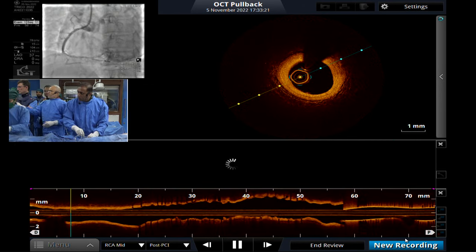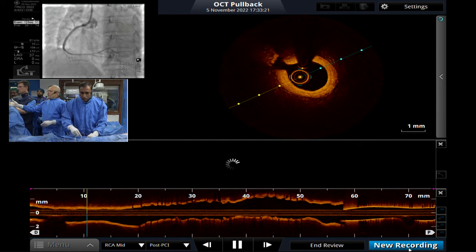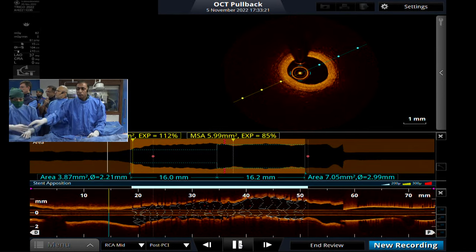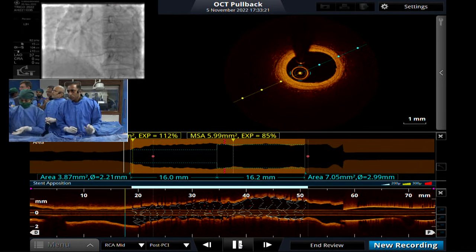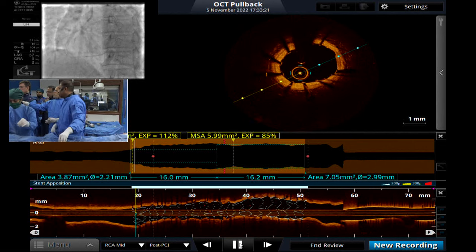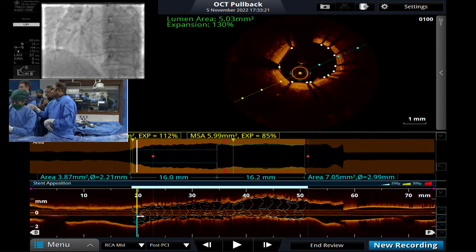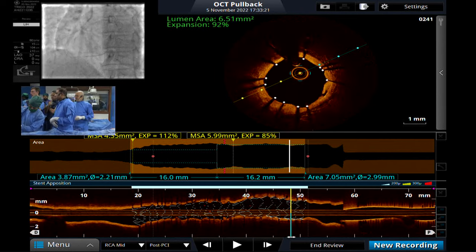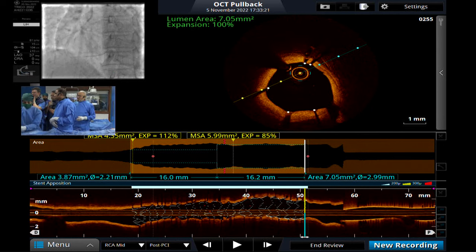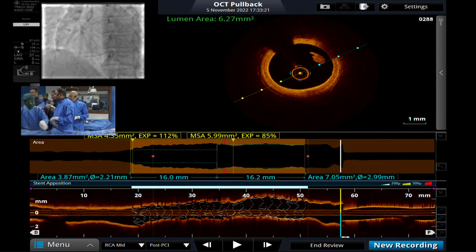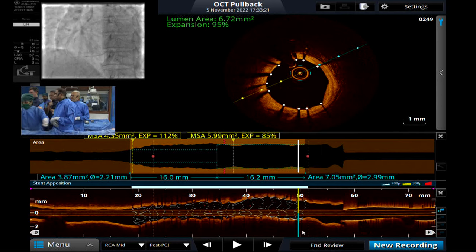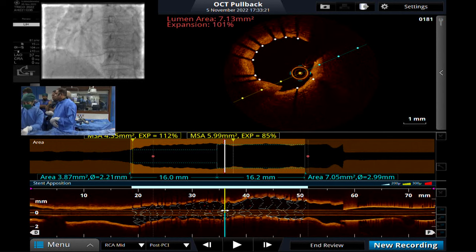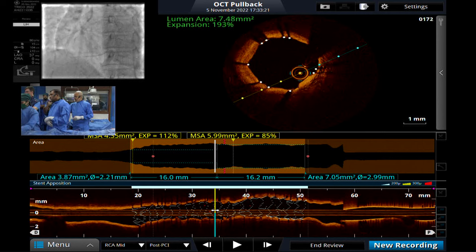This is a perfect result — no distal dissection, full expansion, good apposition, no proximal dissection. The software shows 112 and 85. Somehow the expansion software gets confused with tortuous arteries and significant step-down or step-up, which can be misleading for the average operator. It's a beautiful software but it gets confused.